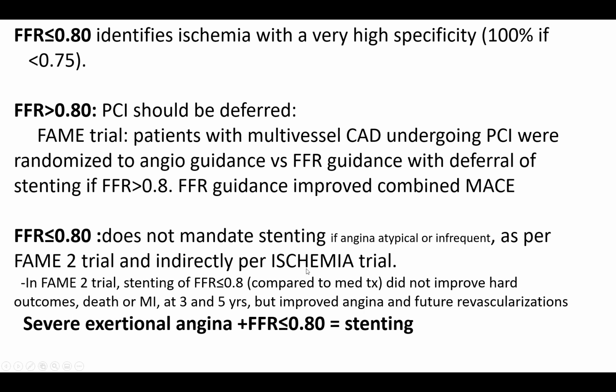As has been shown in several major trials, mainly the ISCHEMIA trial indirectly and the FAME 2 trial directly, stenting of FFR of 0.8 or less compared to medical therapy does not improve hard outcomes such as death or MI at 3 and 5 years, but in the FAME 2 trial, it does improve angina and future need for revascularizations. So FFR less than 0.80 plus severe exertional angina qualifies you for stenting.